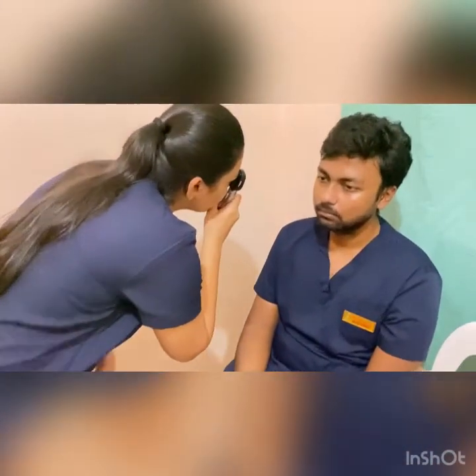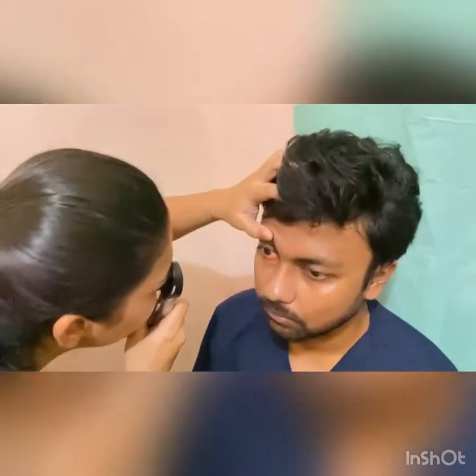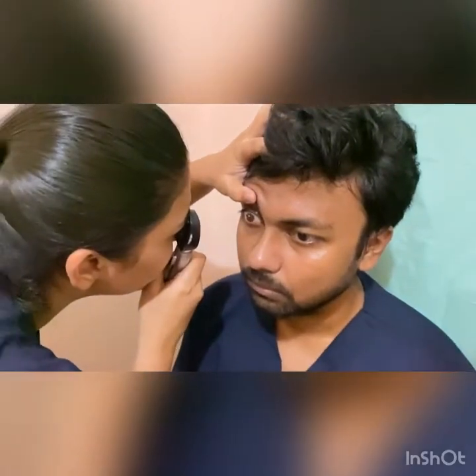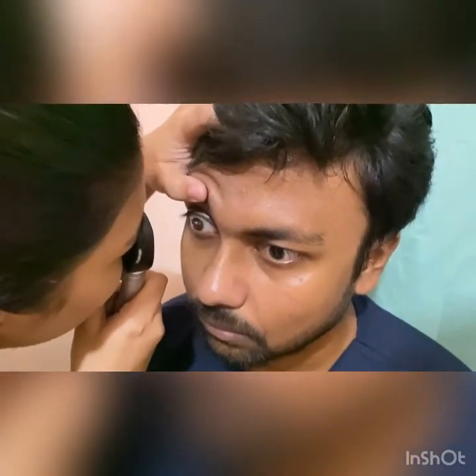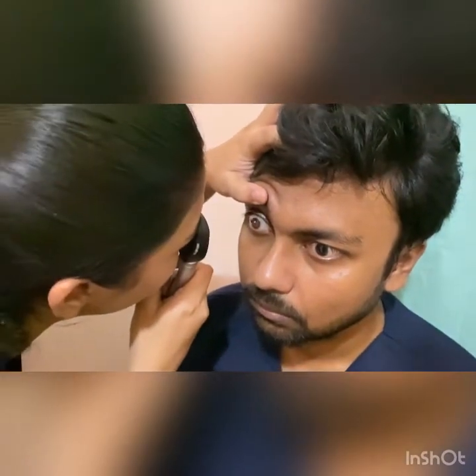Hold the ophthalmoscope with the hand tilted laterally at about a 20-degree slant. Place yourself 15 inches away from the patient and at an angle of 15 degrees lateral to the patient's line of vision. Veins are dilated, whereas the arteries are narrower, and the optic disc and the macula are intact. So that's all for the ophthalmoscopic test.